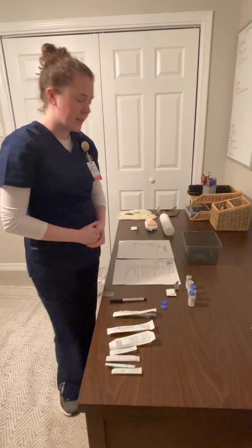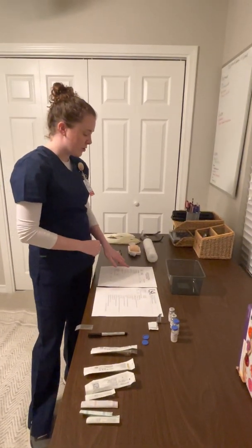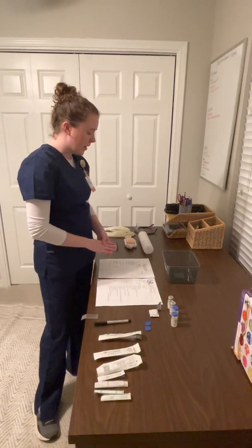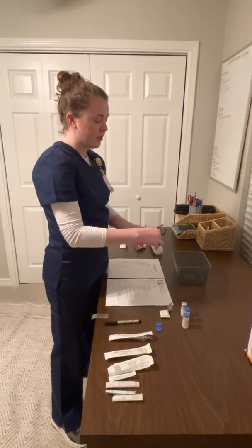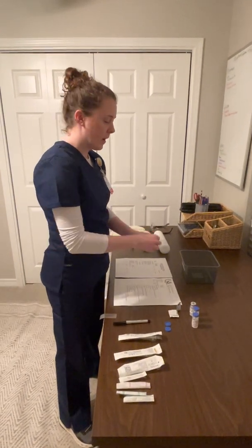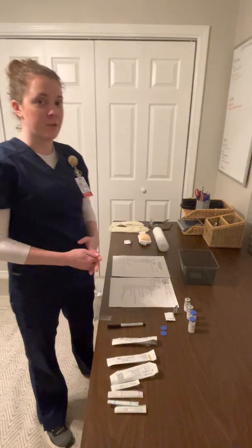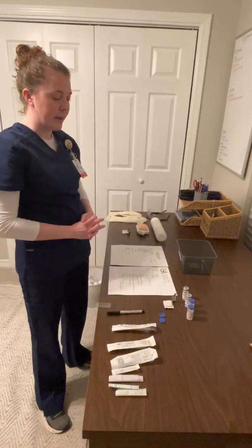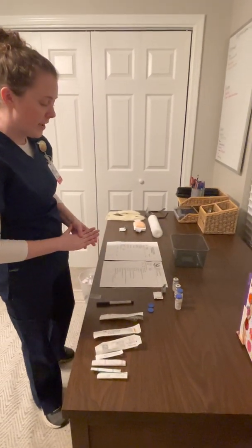And next I would verify the correct dose. So since I've been ordered to administer heparin at 5,000 units subcutaneously every 12 hours, I have a vial of 10,000 units per milliliter of heparin. After doing that calculation, I know that I will be administering 0.5 milliliters of heparin to the patient. Next, I'll go ahead and get my medication and my syringe ready.